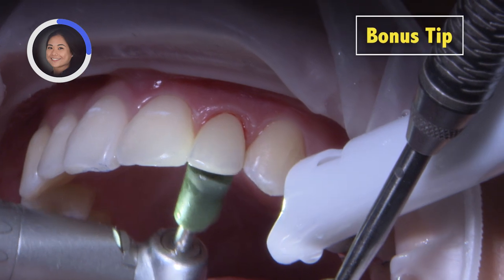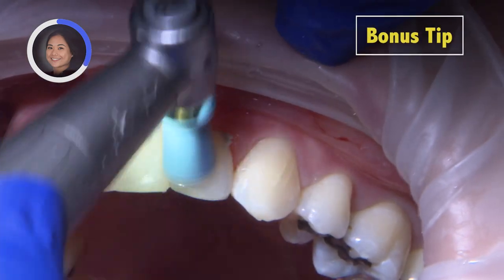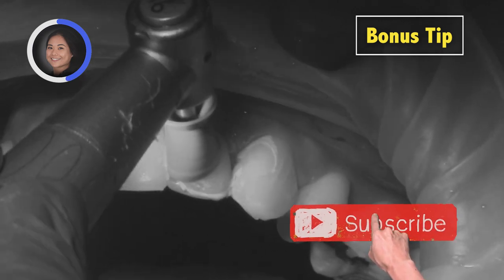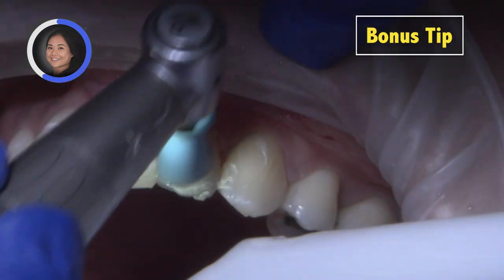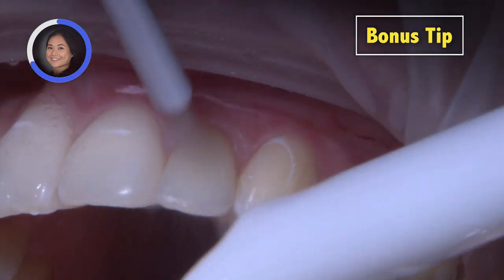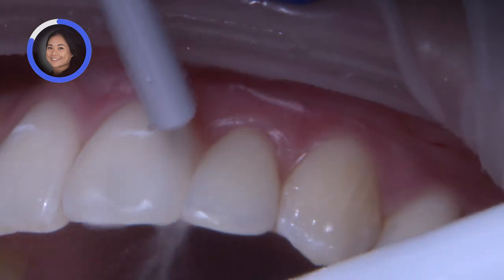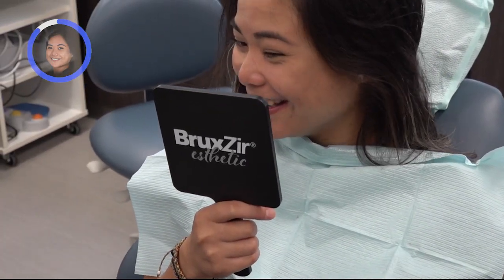Obsidian glass ceramic restorations can be retained with conventional cements, self-adhesive resin cements, or adhesive resin cements. In this case, I chose bonded cementation because it increases the crown strength. Also, resin cement is very color-stable, which makes it especially suitable in the aesthetic anterior zone.